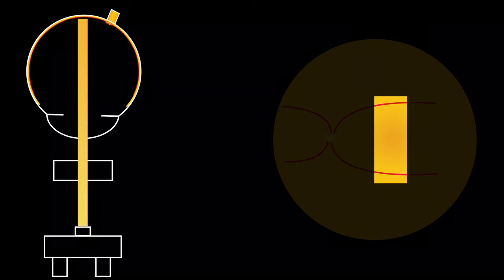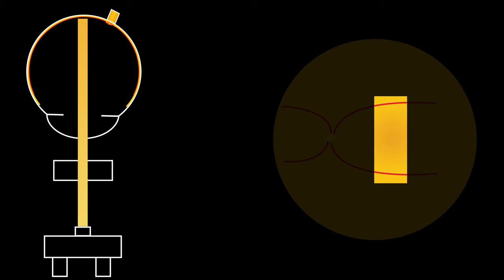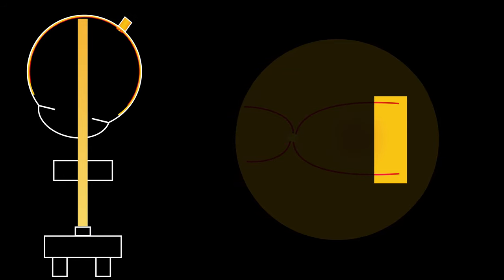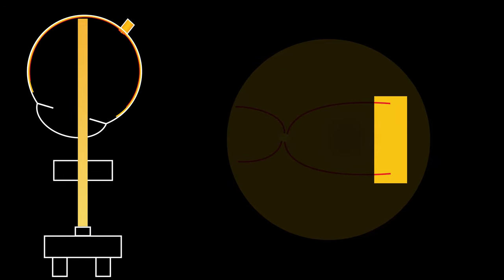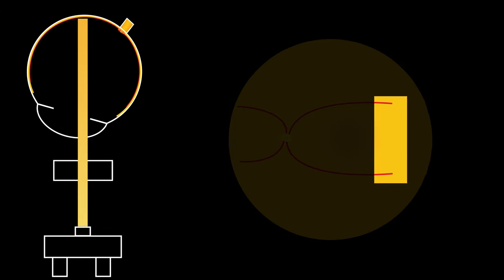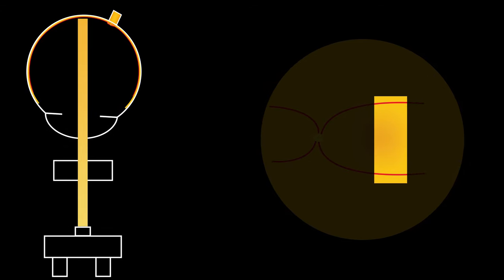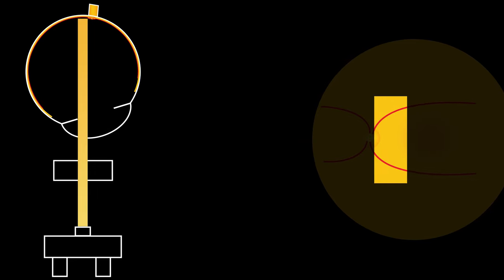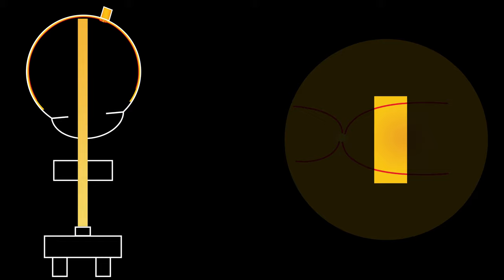But I'm going to show you how to control each of these moving parts. Let's start with the patient's eye. If your patient looks to his right, it looks to you as if you were moving to the right part of your image, in this case more temporally. If the patient starts looking to the left, you start to see the left part of the retina, or in this example, more nasally.